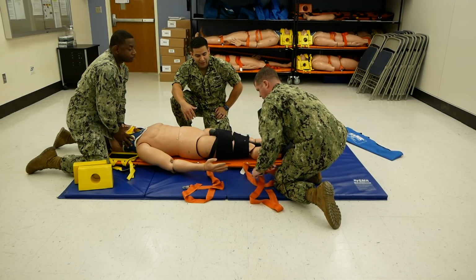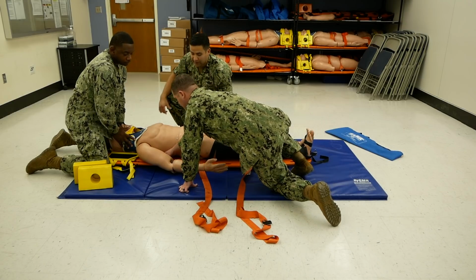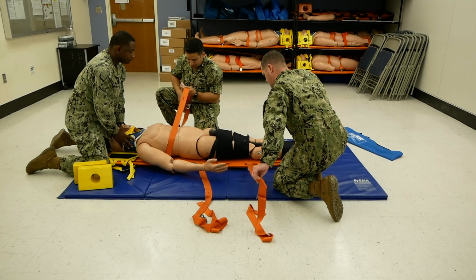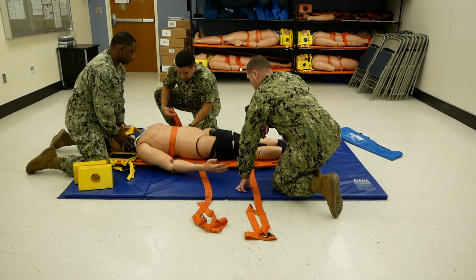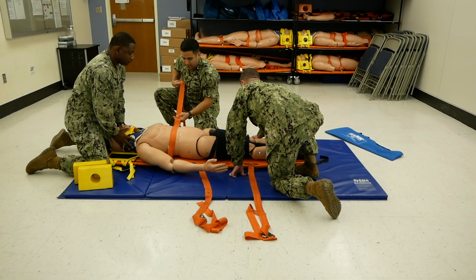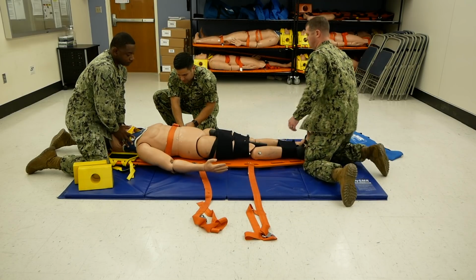We're going to go ahead and strap the patient in, starting at the torso, then around the arms, then the lower extremities, finally strapping in and securing the head. Make sure the straps aren't tangled and the buckles are not upside down before you strap the patient in. Feed and pull technique, feed, pull, and then tuck in the excess straps.